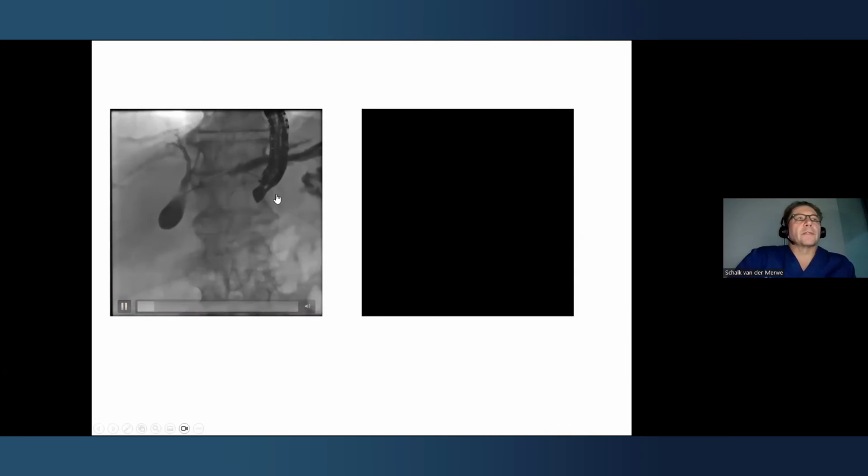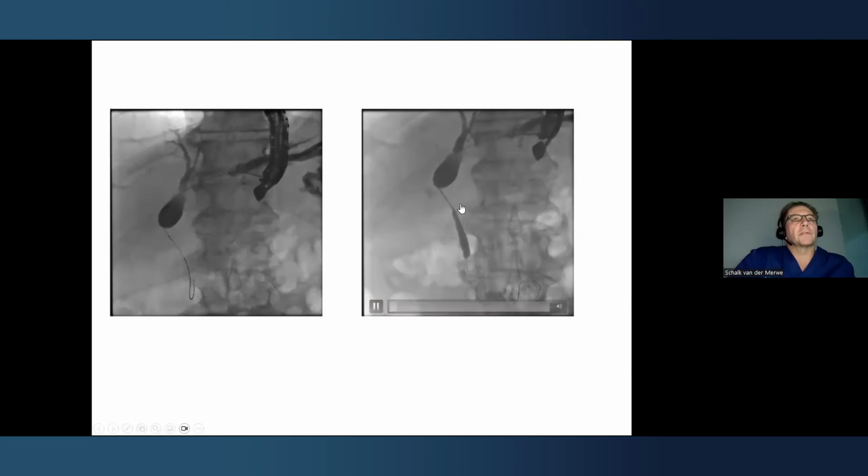Again, here, therapeutic EUS is the gateway, provides access, and the rest of the procedure done at the same time will be guided by your fluoroscopic image. So in this case, the EUS scope is positioned in the proximal stomach. We've accessed a dilated bile duct in the left liver lobe. We've now advanced the guide wire past the stricture and the stenosis. We can identify the malignant stenosis.